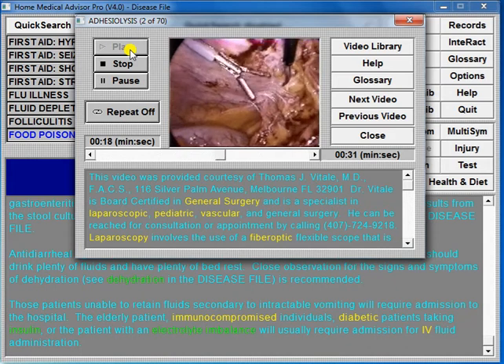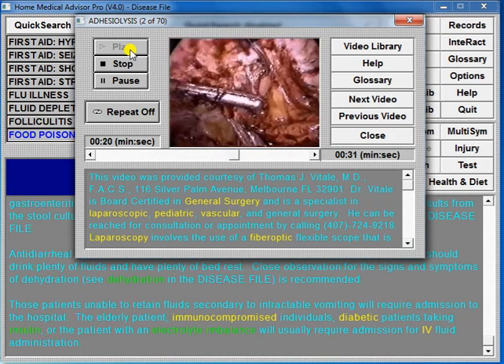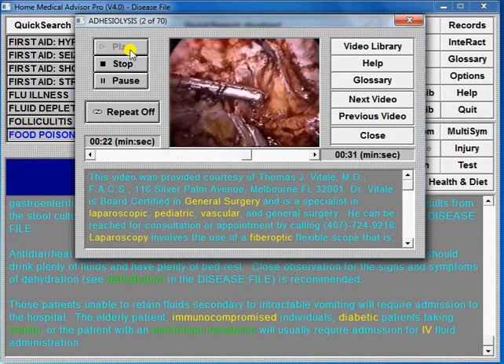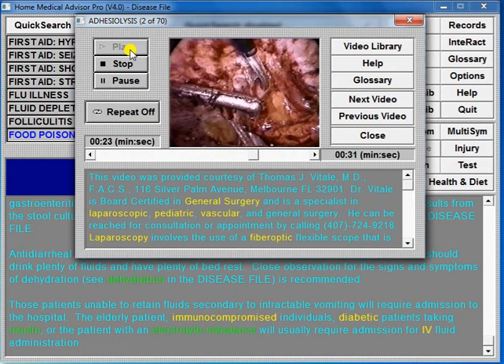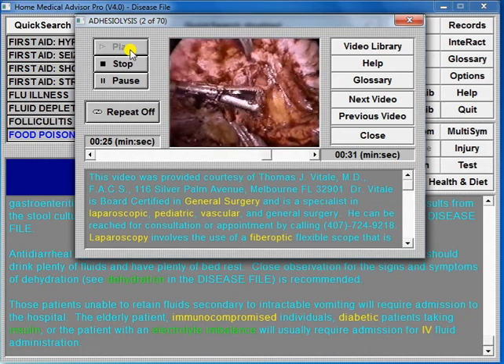Using the laparoscope, adhesions can now be removed through a small abdominal incision in a procedure known as adhesiolysis.